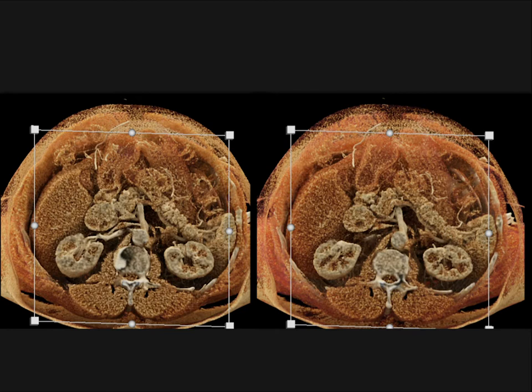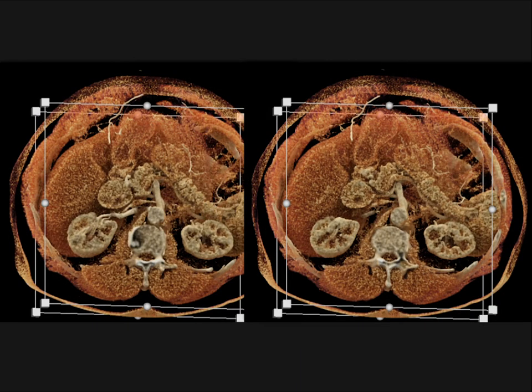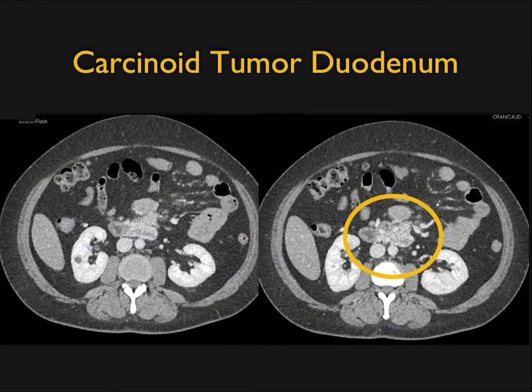visualize. If I take the same case, arterial with cinematic rendering, look how nicely you see that lesion. There's a little cystic component to it. You see the mass. Here it is again with some more textural changes. We then create 3D maps for the surgeon, which shows nicely the SMA and the branches, including the branch to duodenum as well as jejunal branches. And you recognize specifically where the tumor is, though it's a bit harder to see, but it's right above that first jejunal branch.